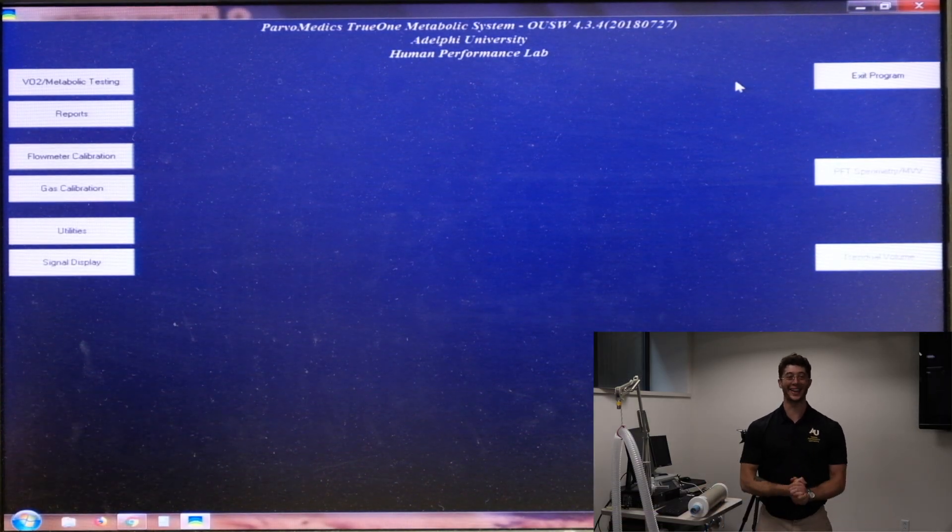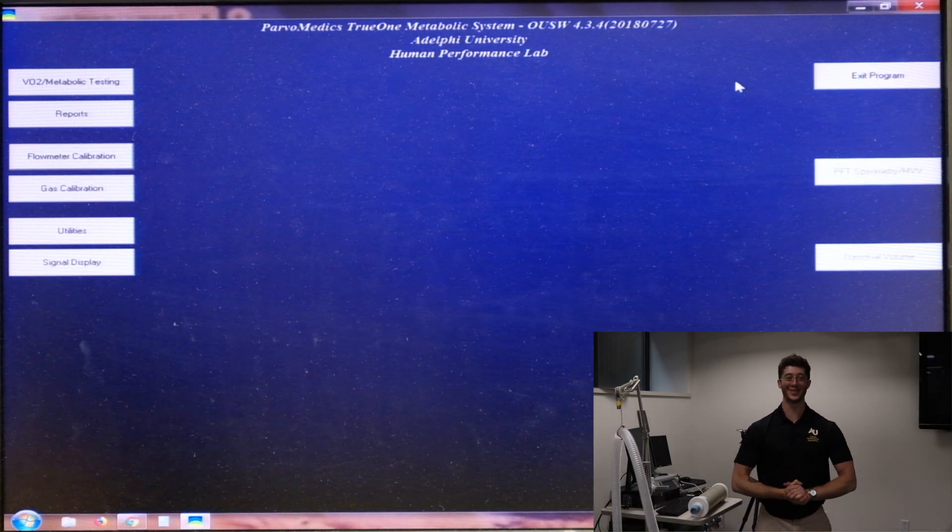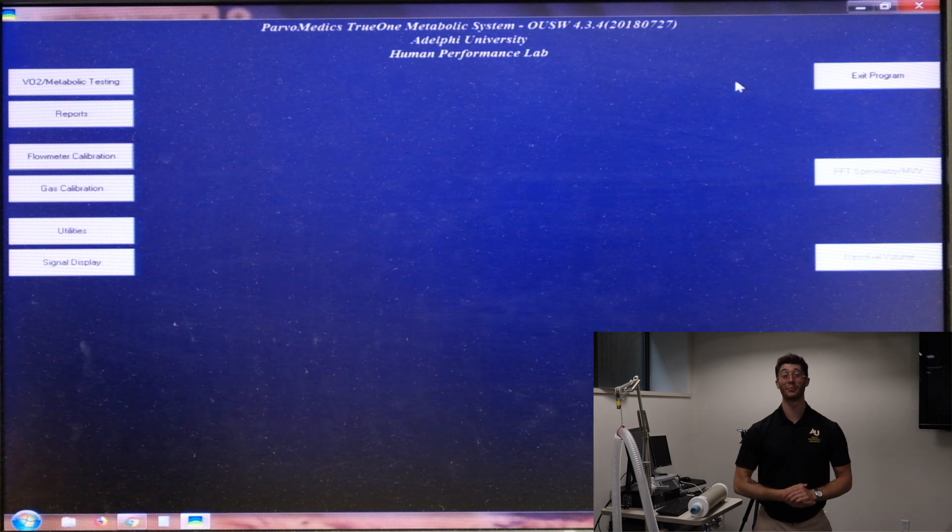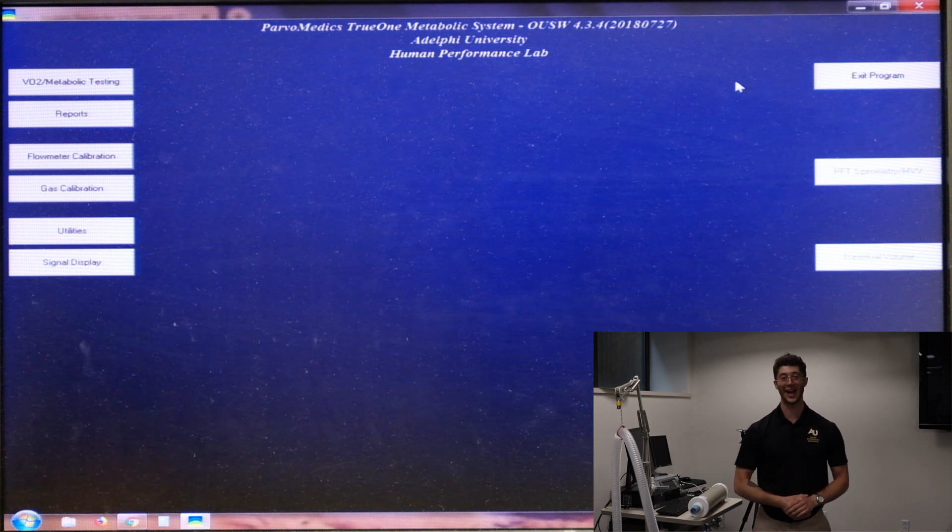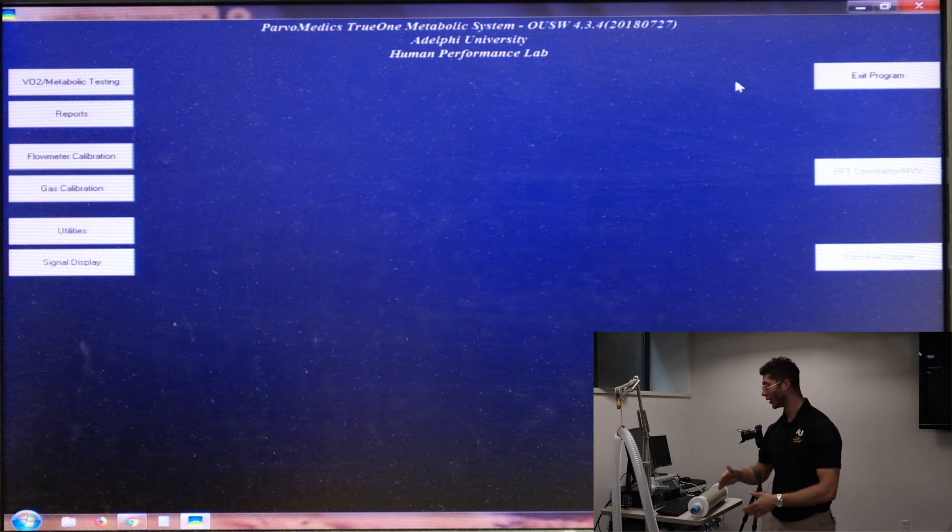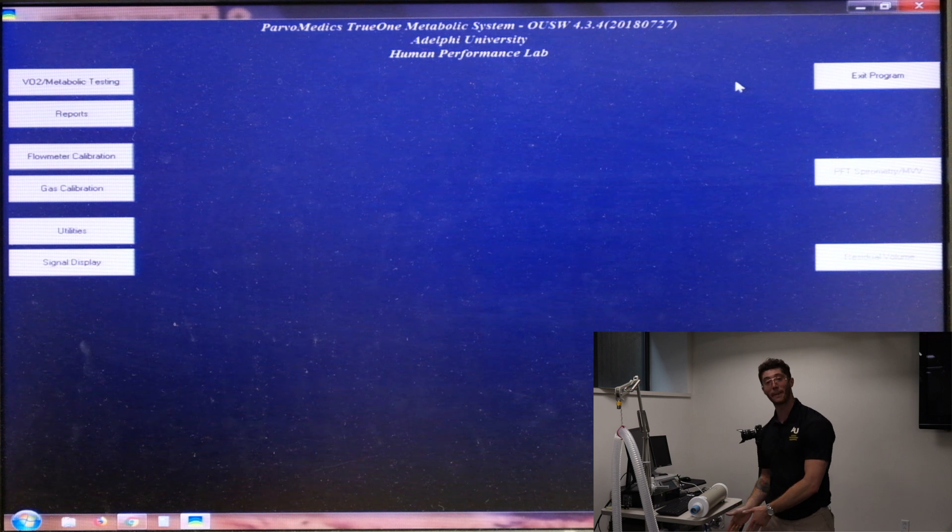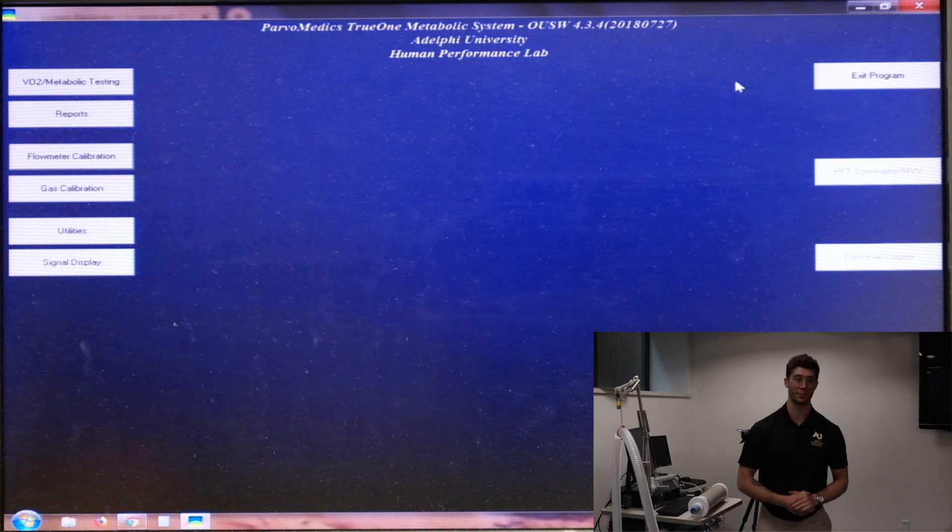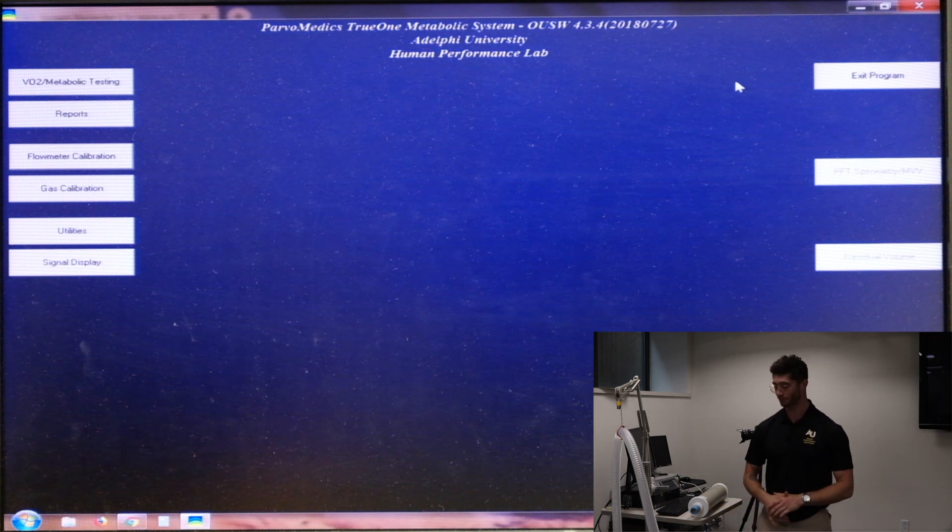Welcome back everyone to the Adelphi University Human Performance Lab where we'll be taking you through the metabolic cart calibration process today.